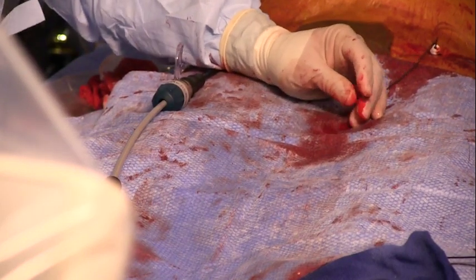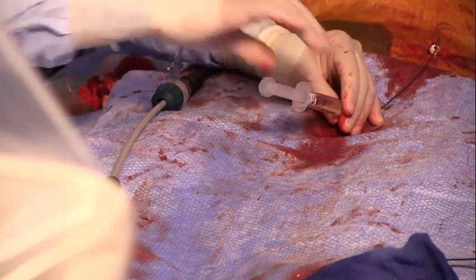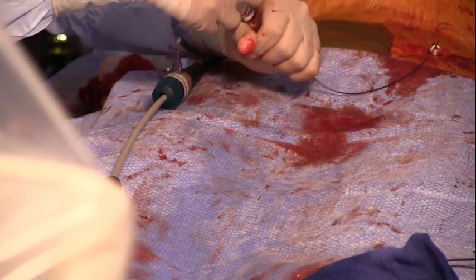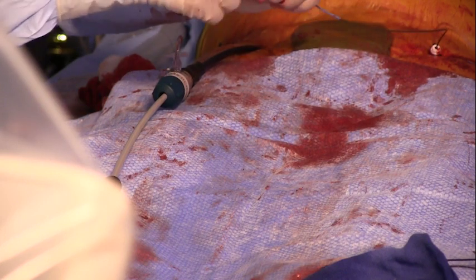Leading with the catheter, point the tip in the apparent direction of the contralateral gate. Then slowly advance the wire until it appears to enter the contralateral gate. This process may need to be repeated until gate cannulation is assumed successful.